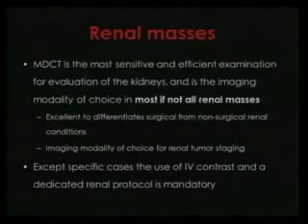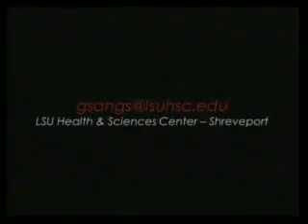Okay, finally, as a conclusion, we have to say that MDCT is the most sensitive and efficient examination for evaluation of the kidneys, and is the modality of choice in most, if not all, renal masses. It's excellent to differentiate surgical from non-surgical renal conditions. It's the imaging modality of choice for staging, and except for specific cases, the use of IV contrast and a dedicated renal protocol is mandatory. And I think this is the last slide. Thank you for your attention.